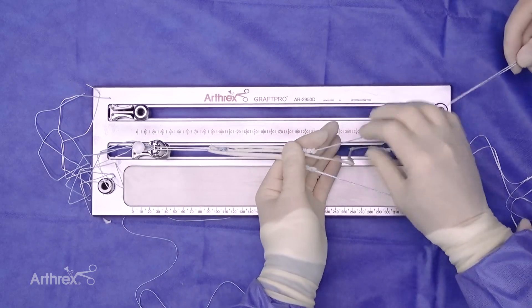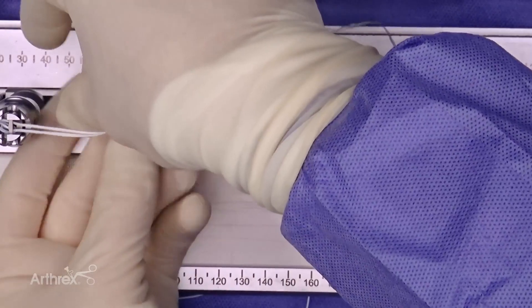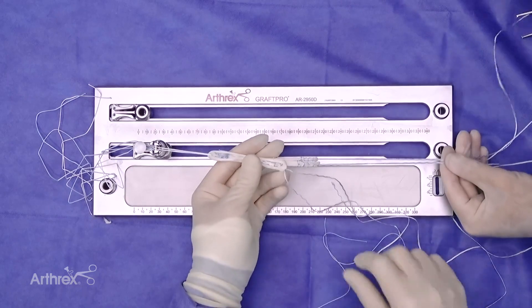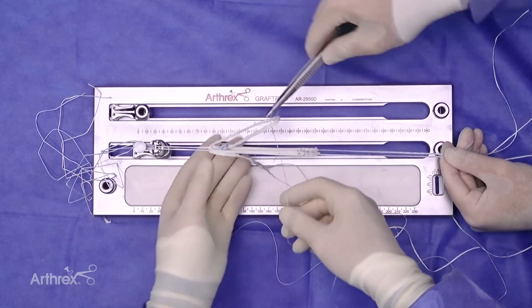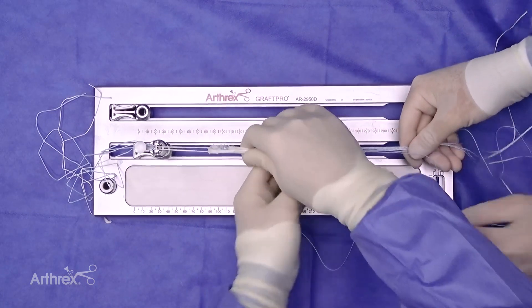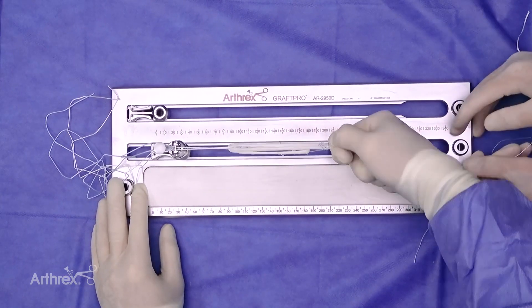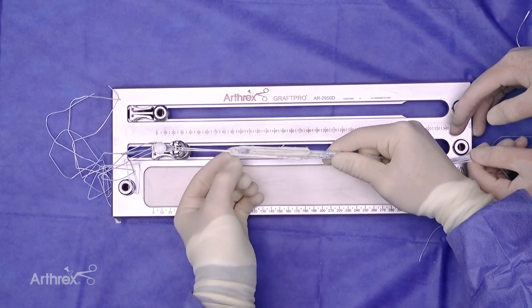The sutures are brought over again. The graft is then looped and brought down in a five-string construct, as identified here. A final suture can then be placed through the loop to provide the ability to tension the fifth limb at the knuckle of the construct. In this fashion, a five-string autograft is created using the fiber tag at the interface, securing both the tendon to the tightrope and all loops through the tightrope with a final appropriate construct strength.